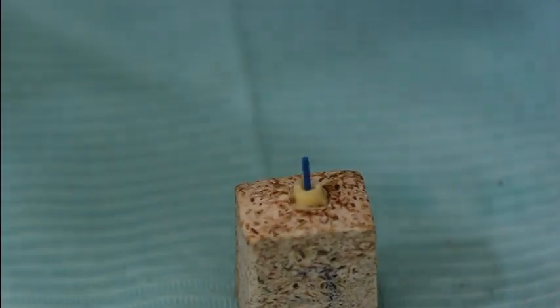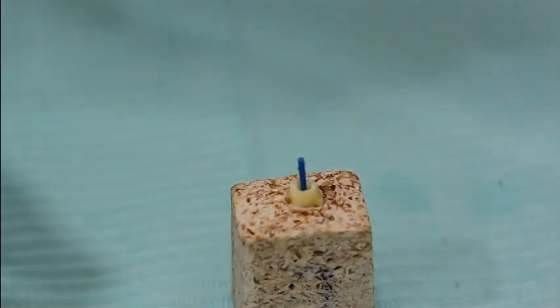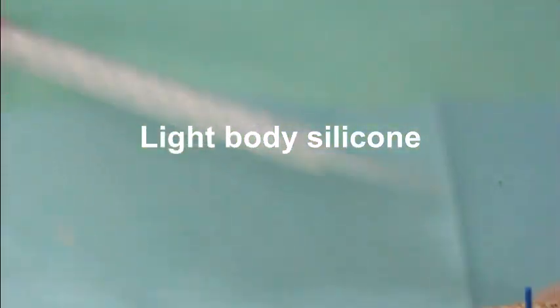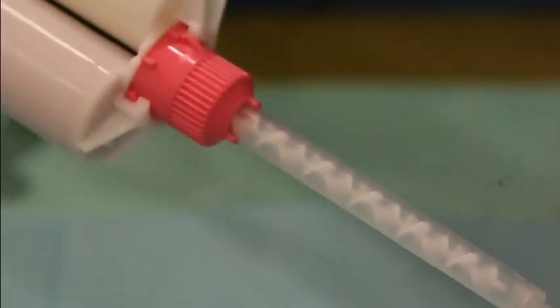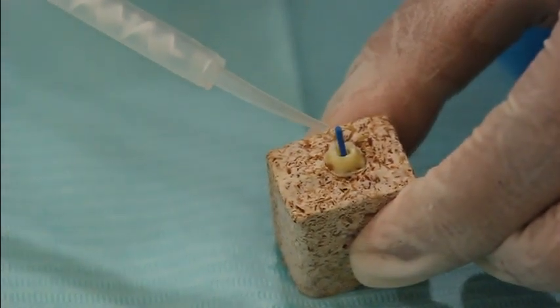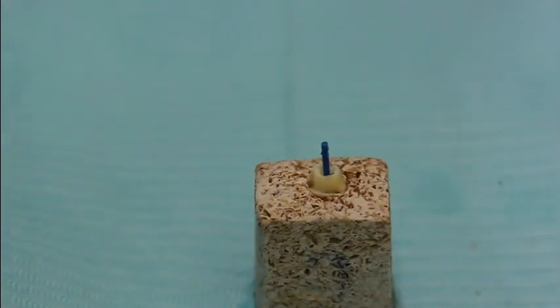Okay. As for impression, we're going to use light body silicone. You need to have one injection syringe to be filled in inside the canal, and then another one to load the impression material on the tray.